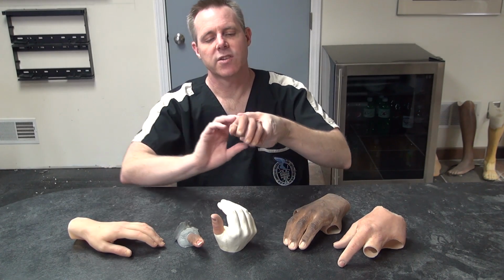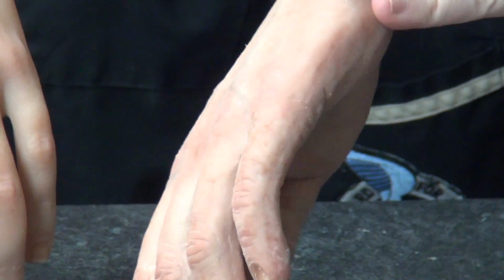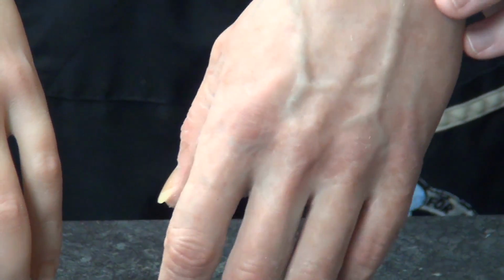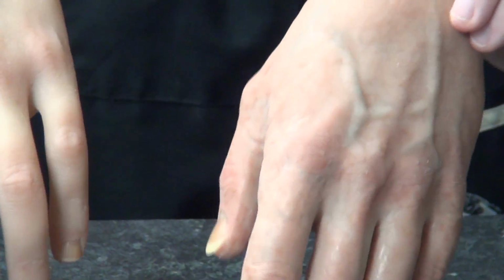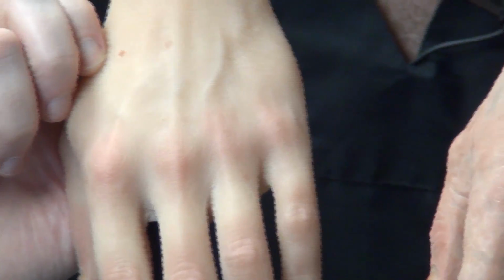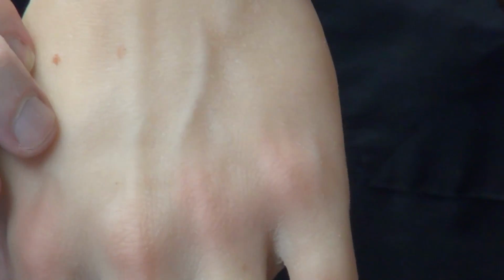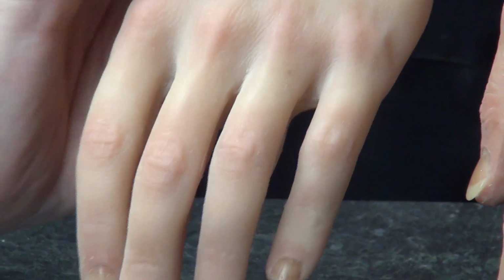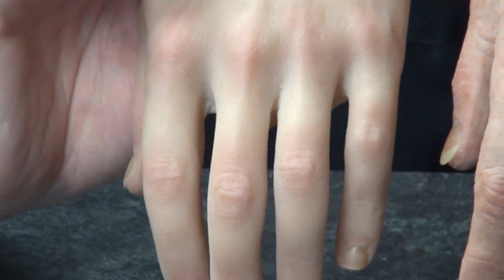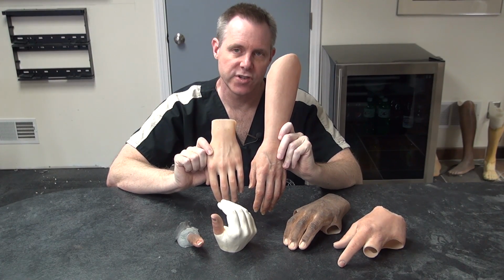One of the things about this, and why I've got this hand here, if we can get a close-up, is that this one is a hand-sculpted prosthesis, which in some cases is the best way to go, depending on what you're trying to achieve. I've got hand-sculpted pieces and what I call life casts. People think life casts are cheating, but they're not necessarily cheating. It's just another solution to a problem. Hand sculpting gives you a certain level of realism, but also a lot more power and control over the shape and the design.